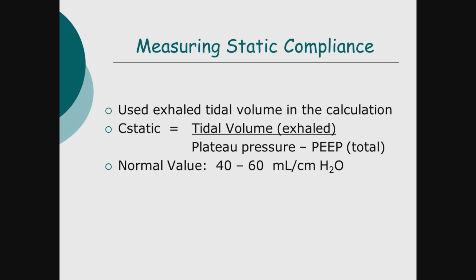We know that static compliance, we looked at the exhaled tidal volume over the plateau minus the total PEEP, and the normal value on a ventilator is a little bit less than what the normal value is. Normal value would be 100 milliliters per centimeter of water. You get a little bit of a reduction just by placing an endotracheal tube into the person.